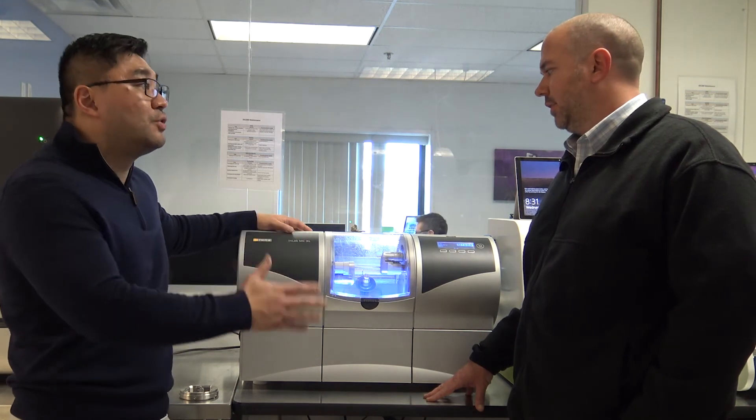So does each mill have its own CAM software? No, we have one CAM software and you can control as many mills as you want from that one CAM software. For example, if you have four MCXLs, you can have one CAM software running all four mills. Correct. Okay, very neat.